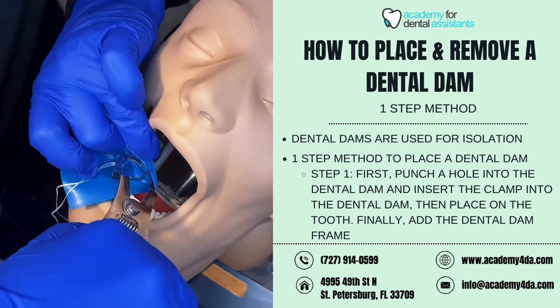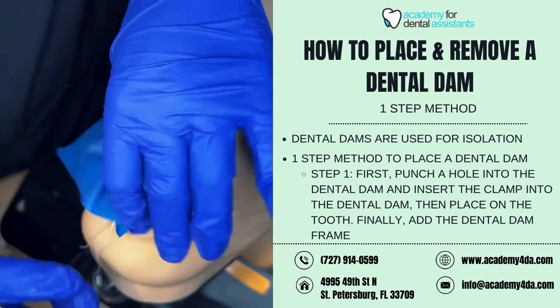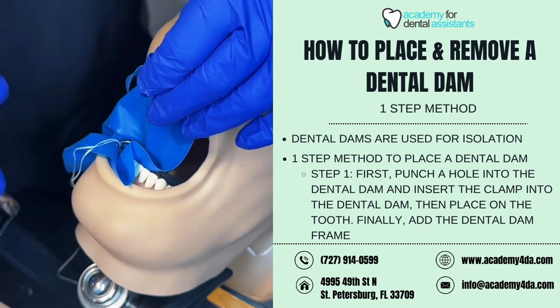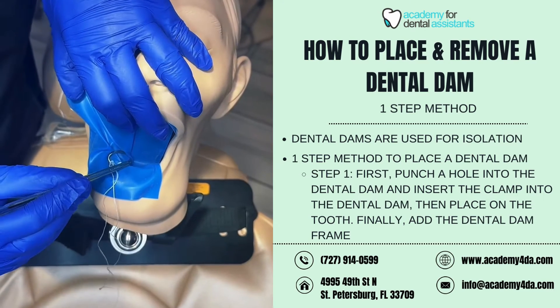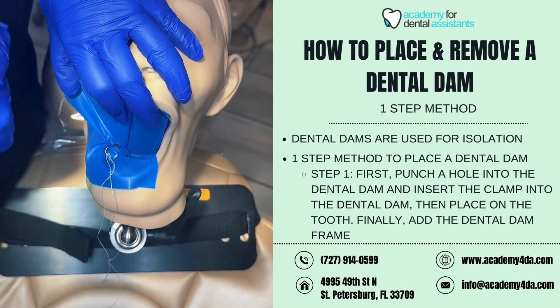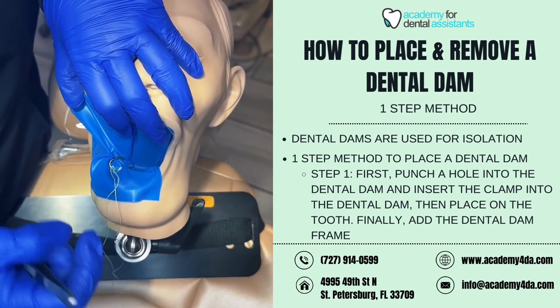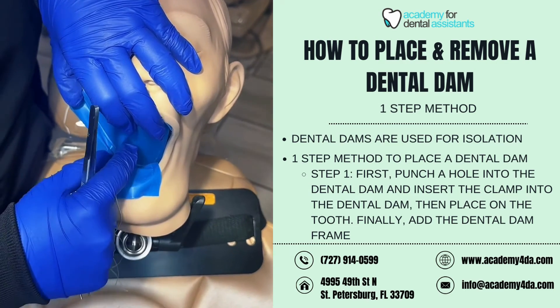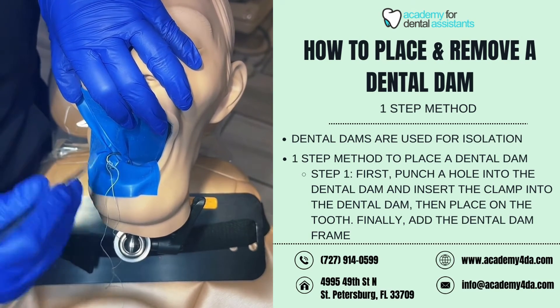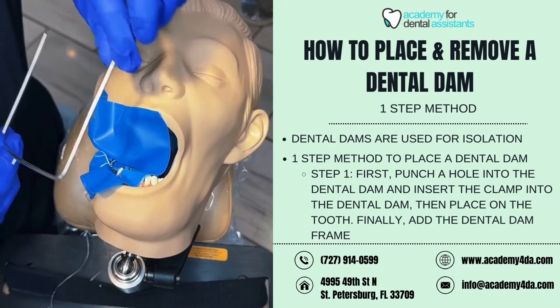Now I'll grab my extra material — my dental dam — and place this onto the premolar. You don't want the clamp to be resting on the gingival tissue; you want it to be right above it. I always have the bow — the circular part of the clamp — towards the distal, towards the back of the mouth. Make sure you're placing it right around the gingival margin and not on the tissue. The patient is numb, however they would still feel pressure — remember, you cannot numb pressure.